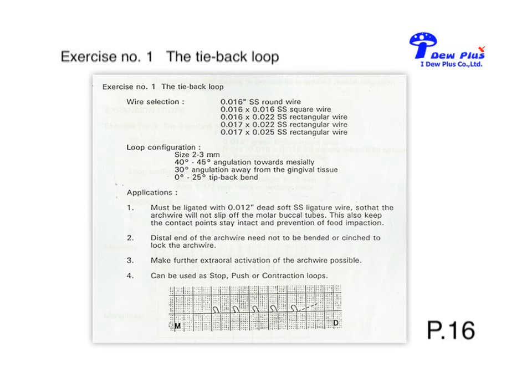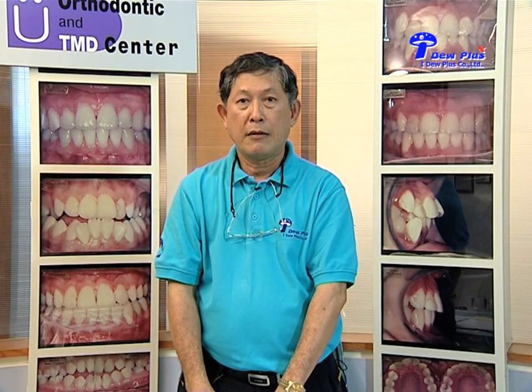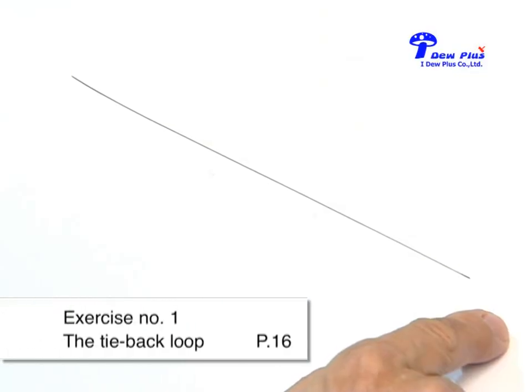The tie back loop can be used in .016 stainless steel wire, .016 by .016 stainless steel square wire, .016 by .022 rectangular wire, and .017 by .022 rectangular wire. Now, let me show you how to bend the tie back loop. Next, we are doing the extra elements.